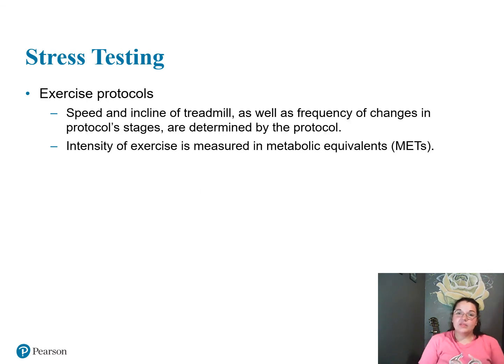Okay. So, what are my protocols when I have a patient doing a treadmill test, a stress test? The speed and the incline of the treadmill, as well as the frequency of changes in protocol stages, are determined by the protocol. The intensity of exercise is measured in what's called metabolic equivalents, METs. This is something else you need to know.